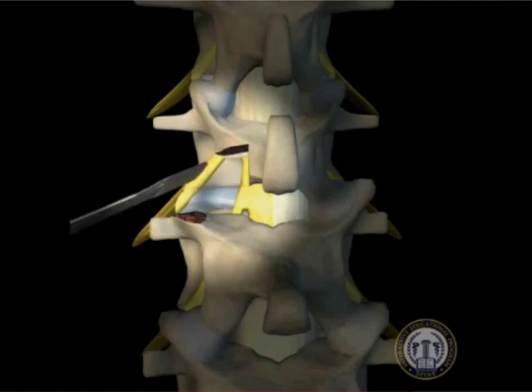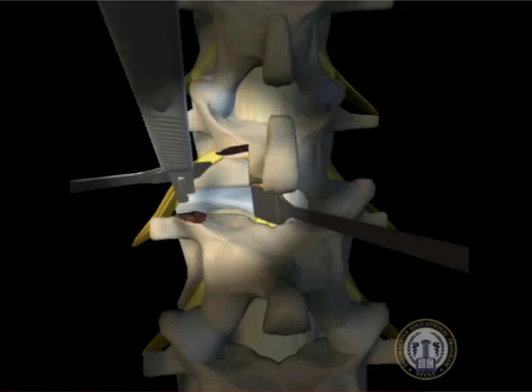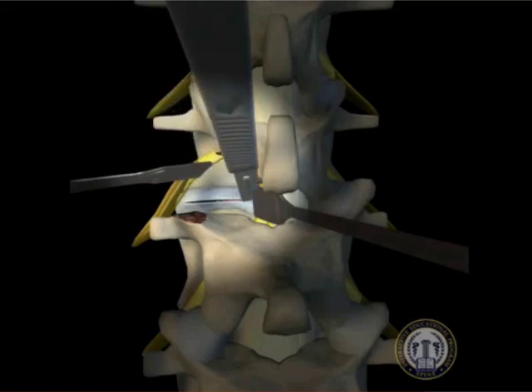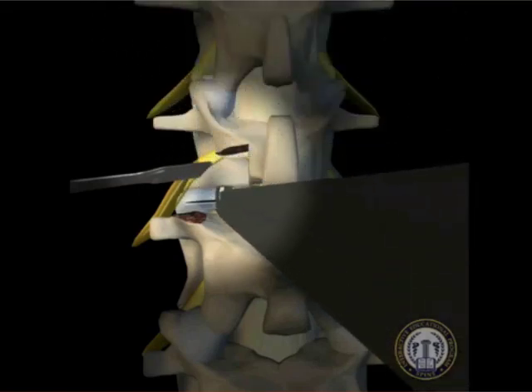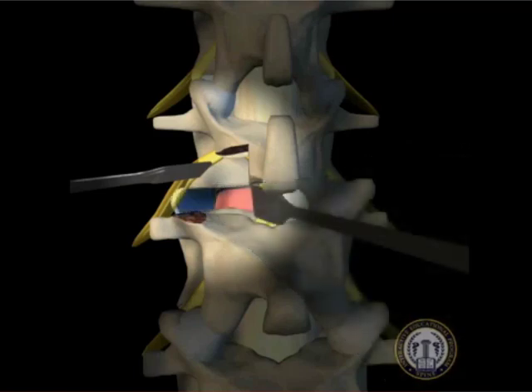With the traversing and exiting nerve roots protected, a complete discectomy is now performed using a number 15 blade to incise the annulus and thoroughly remove all nuclear material. The success of the fusion is dependent on thorough removal of all nuclear tissue, so time should be taken to visualize a complete and thorough discectomy.